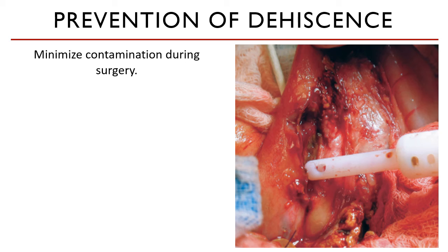The intestinal contents must be milked out, orad and aborad, from the planned incision and occluded well with forceps or fingers. Lavage the surgical area and catch all spillage with your lap sponges. Dispose of all lap sponges, gauze sponges, and replace them with new ones. Change your gloves and instruments before closure.